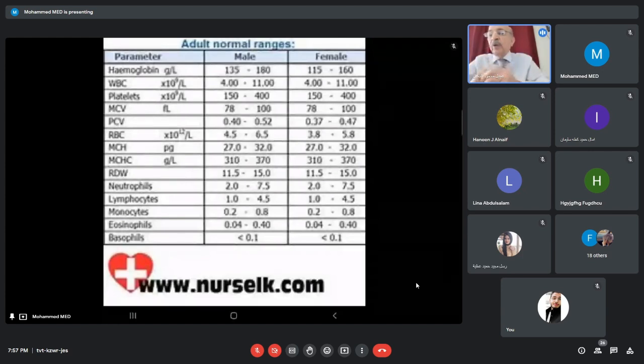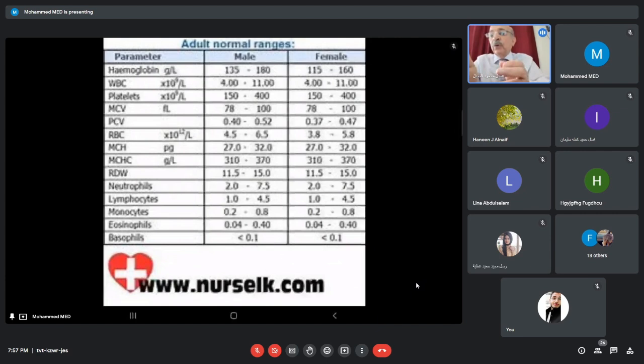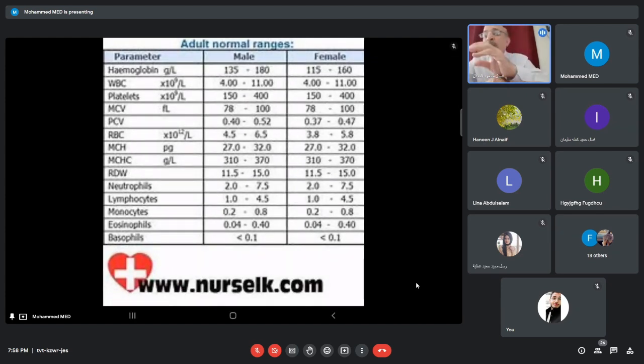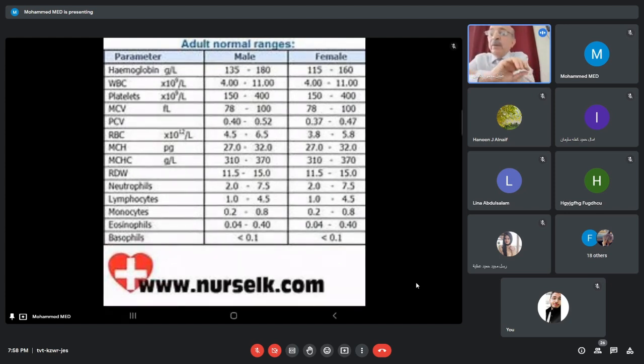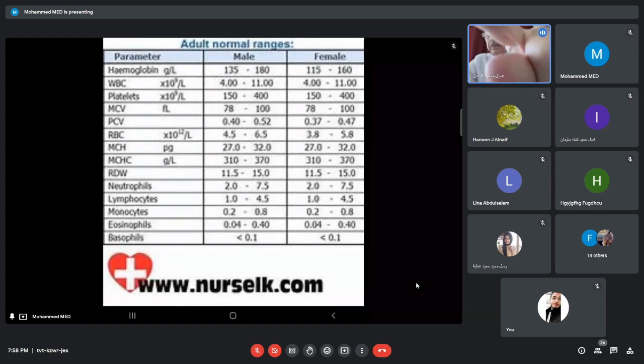Not always, sometimes the hemoglobin is in the middle. But look to the hemoglobin, and this slide is showing the normal values for male and female, and I hope that you all know the normal values for male and female, but anyway, it should come on the form. Okay, so always look to the form because there is usually a slight variation from one lab to the other. And then you get the white blood cells and the platelets. These are the main three.